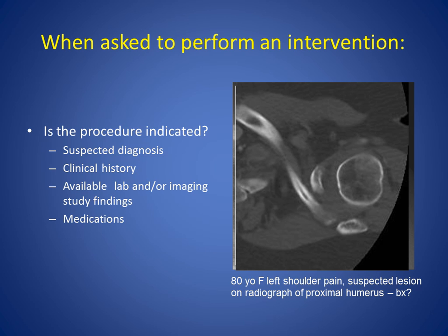We do not have any other cross-sectional imaging other than a chest CT. In a chest CT, the arm is typically raised up over the head. So this is the chest CT. We just get a few images of the humeral head. Looking at this, you can see the marrow fat within the epiphysis of the humeral head, and you can see the proximal humeral metaphysis. And where's the lesion?